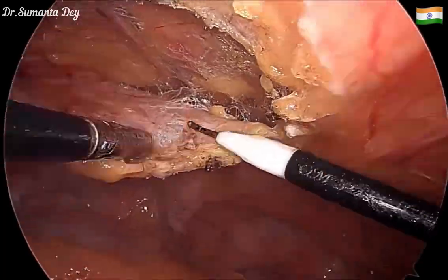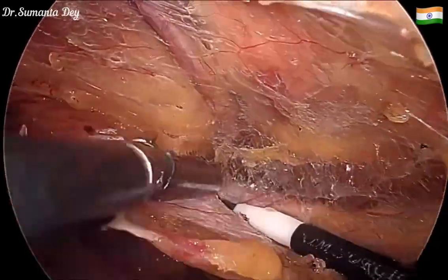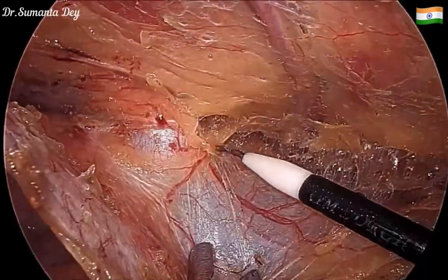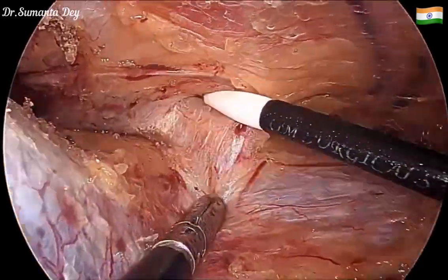Towards the lower part near the pelvis, I'm raising the peritoneal flap. You can now clearly see the inferior epigastric vessels, and I'm gradually creating further plane along them.